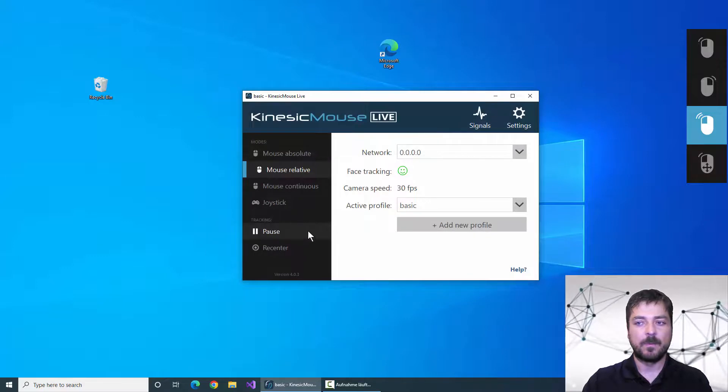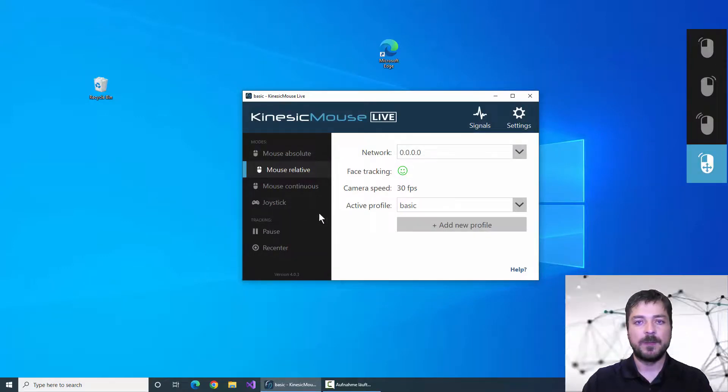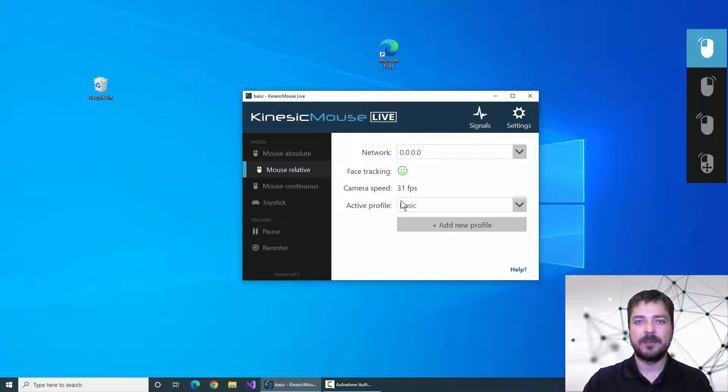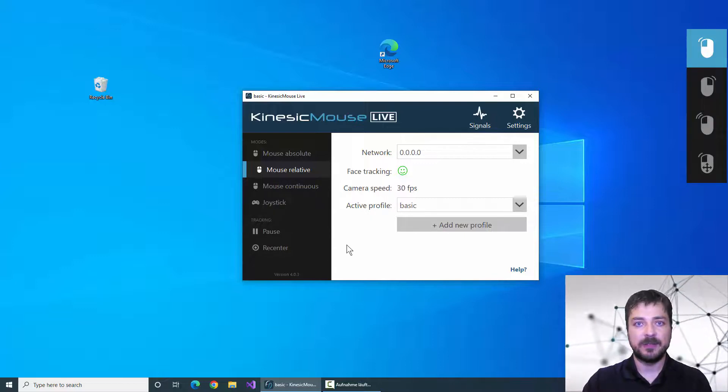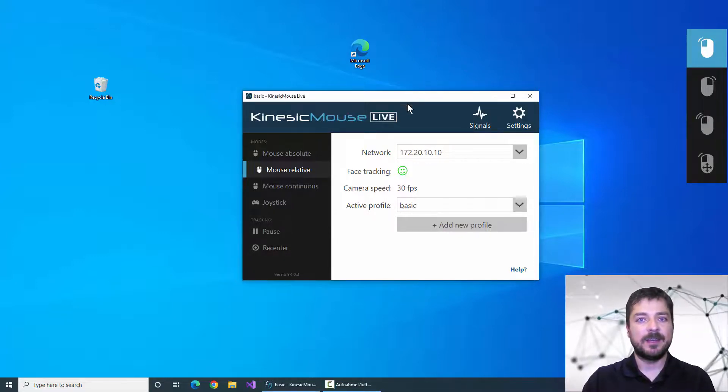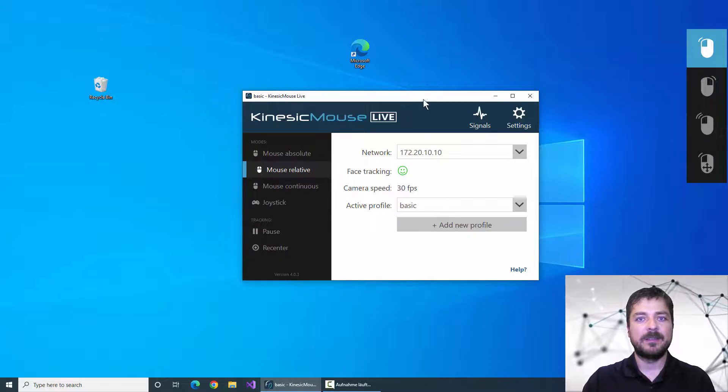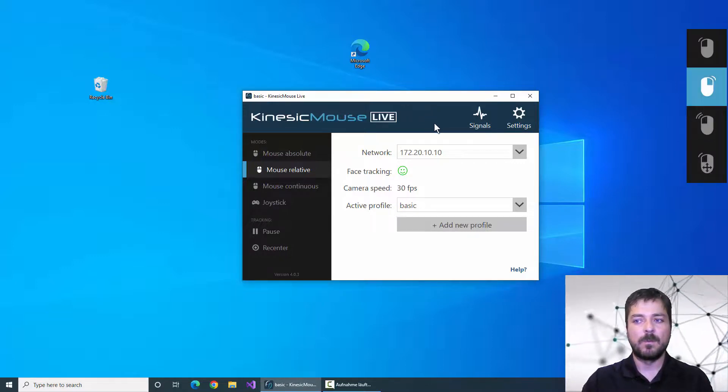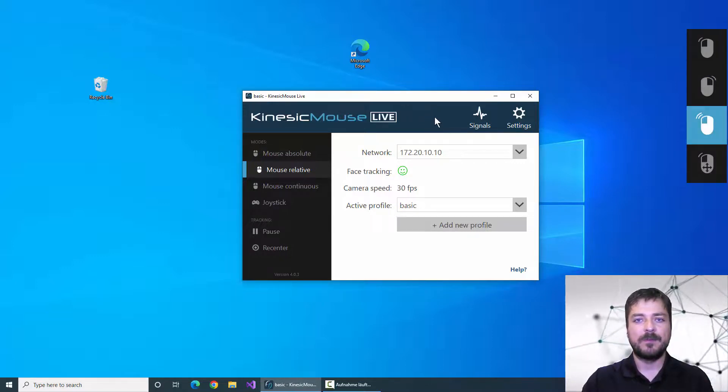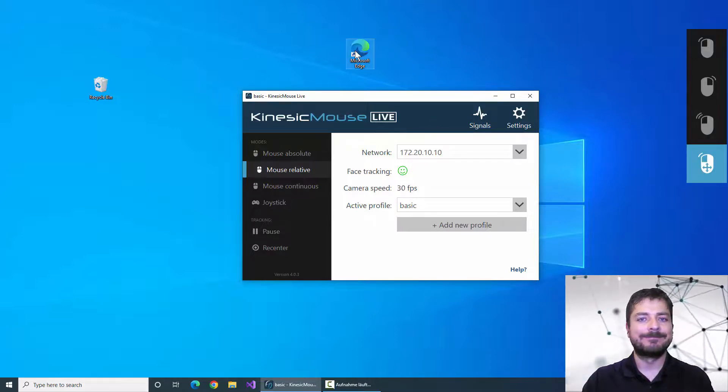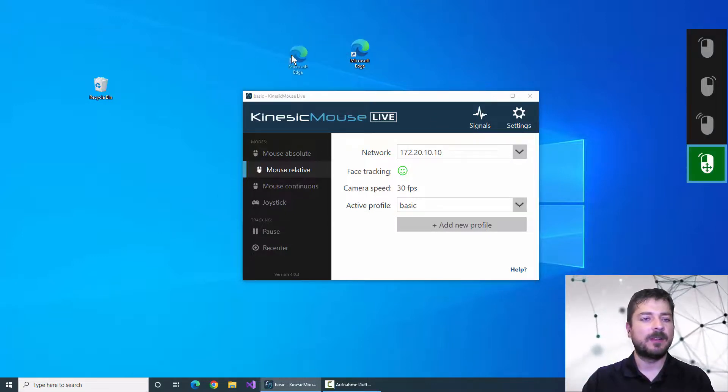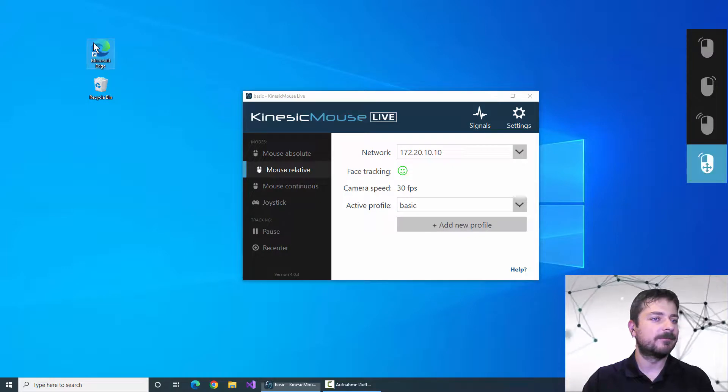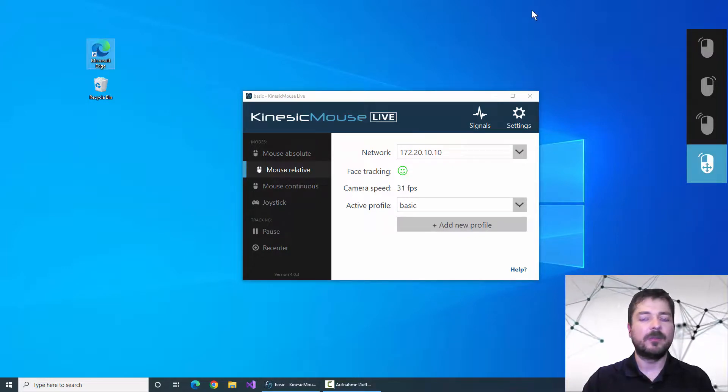we can see by puffing my cheeks I can select the mouse buttons in the click switch menu. So if I want to drag the icon back into place I select the click and drag by puffing my cheeks, smile to activate the click and drag and drop the icon wherever I want.